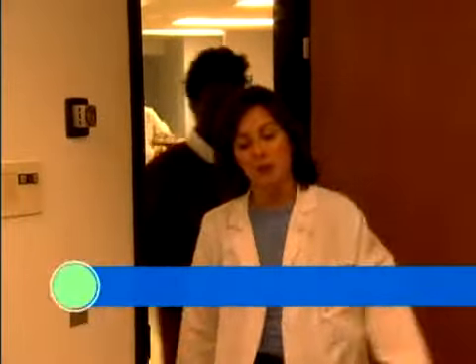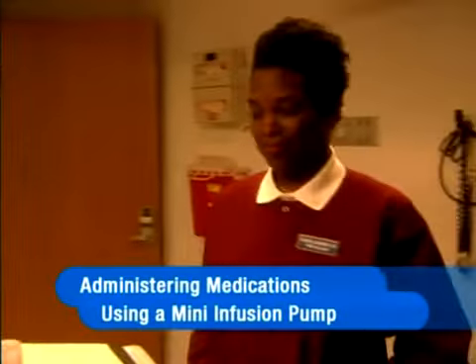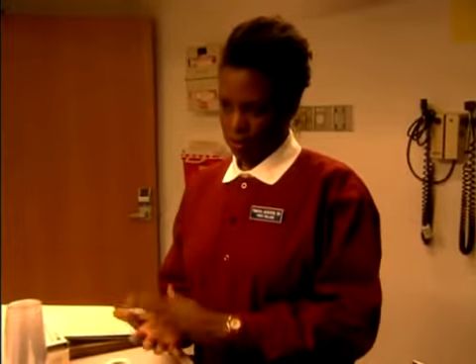Tamika, I'd like to look in on your patient that's receiving intravenous antibiotics. Okay, sure. What will you be doing? I'm going to be administering my patient's antibiotic with a mini infusion pump. That's also known as a syringe pump, right? Right. And what will that entail?